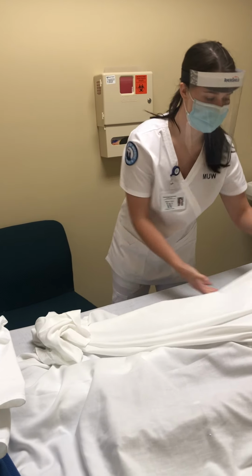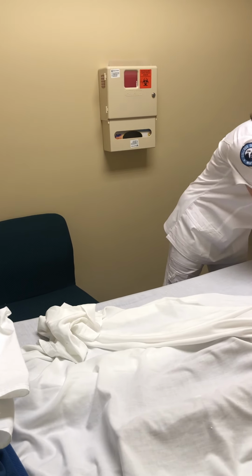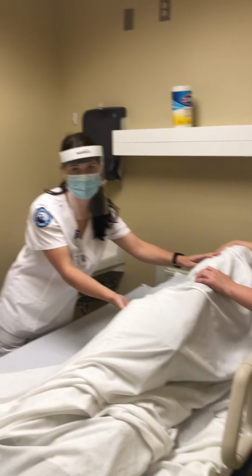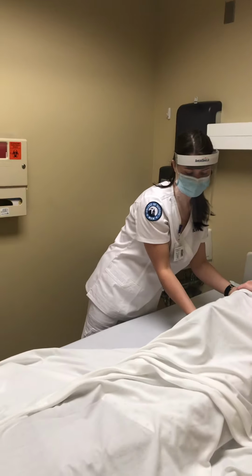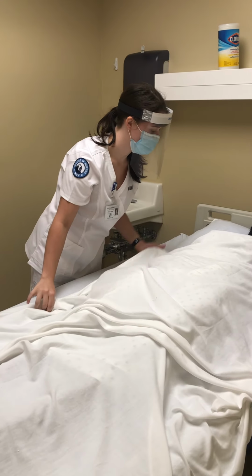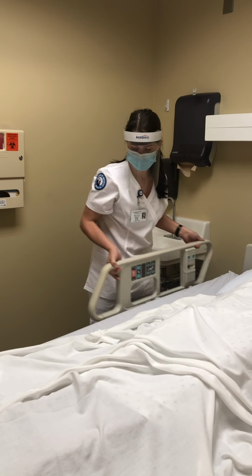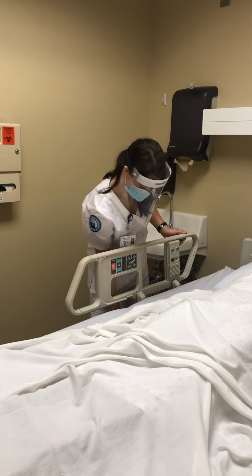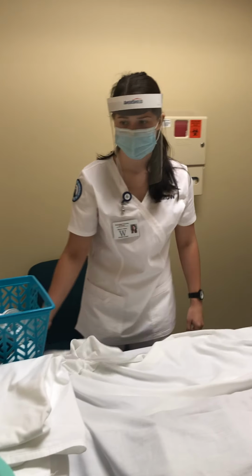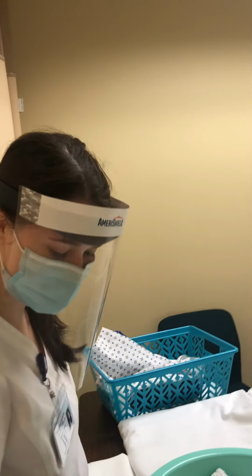We're going to pull the sheet back out to keep our patient covered, and we're going to roll her back over. Then I'm going to lift the bed railing, again ensuring that it is tight. Going to come do the other side.